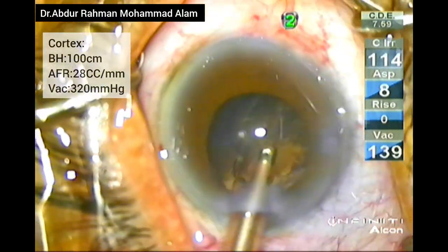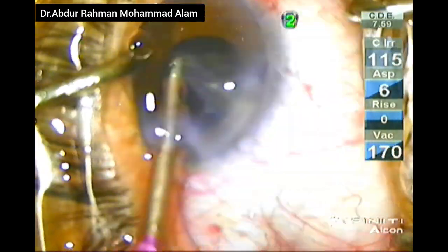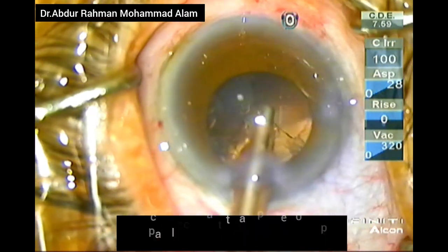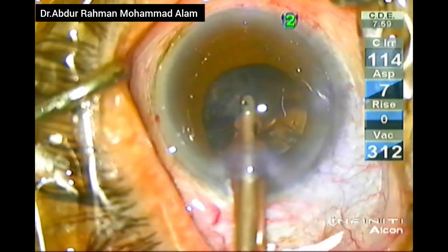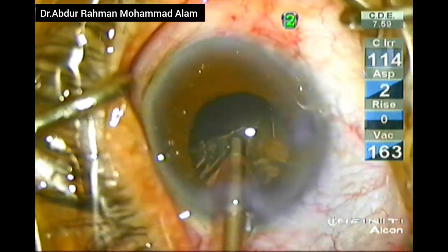Now I am performing cortical removal with a straight tip IA. I am successfully removing all the cortex. This cortex is a little bit thick and unable to remove easily. You can either increase the vacuum or use a spatula to crush the cortex in the aspiration port. In a 360-degree manner, I am removing all the cortex from the capsular bag.